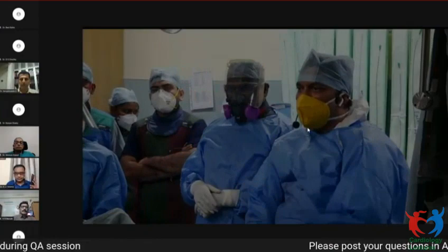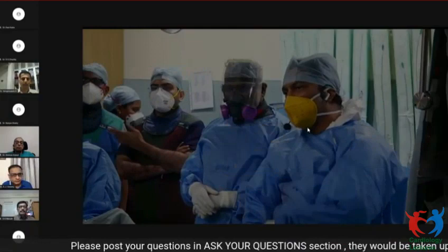There is a long segment lesion of the OM. Can you please pass them to show the fluoro? Bifurcating into two branches. So that branch, the subdivision, also has a lesion.